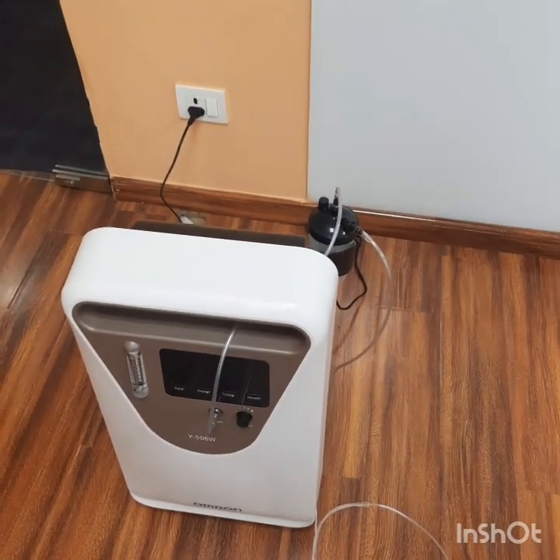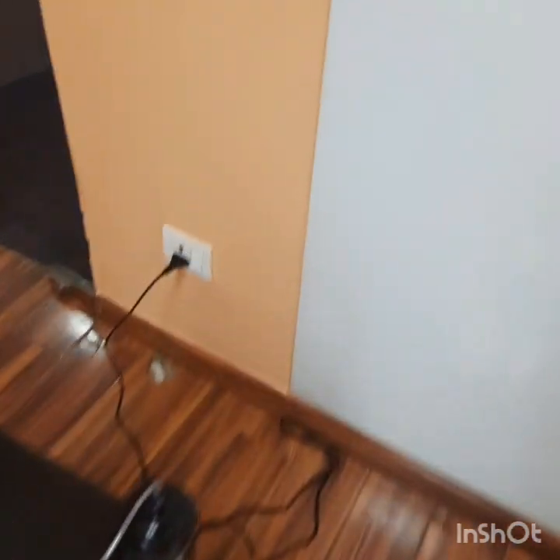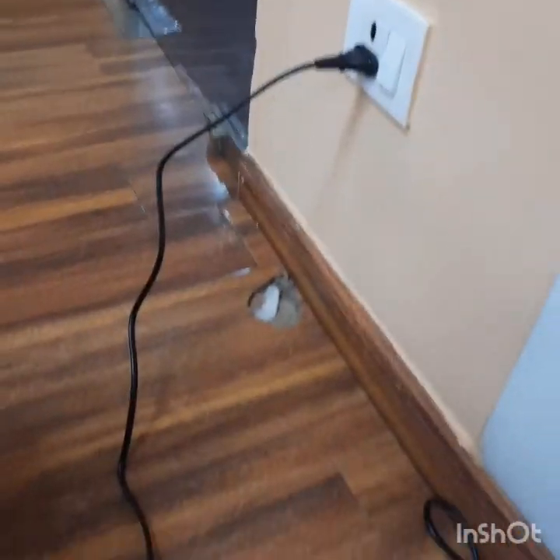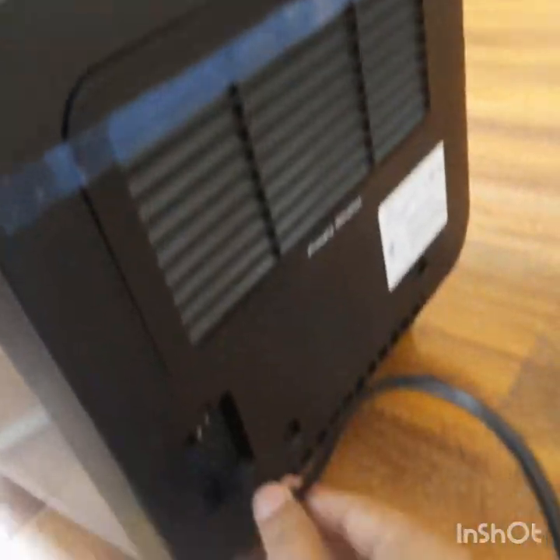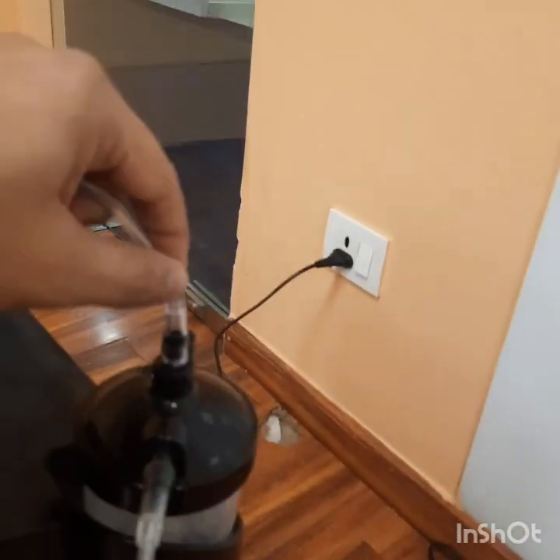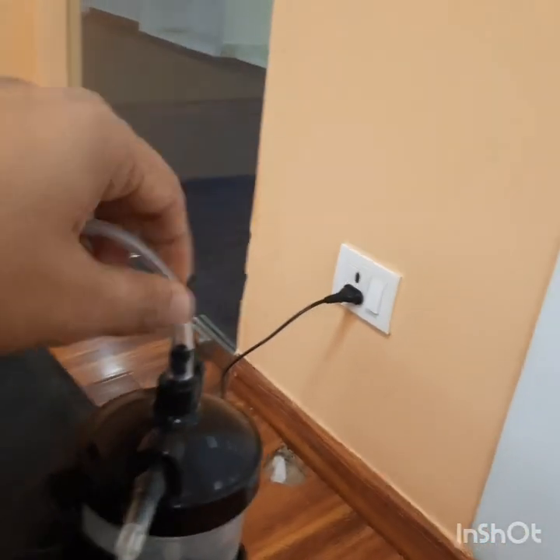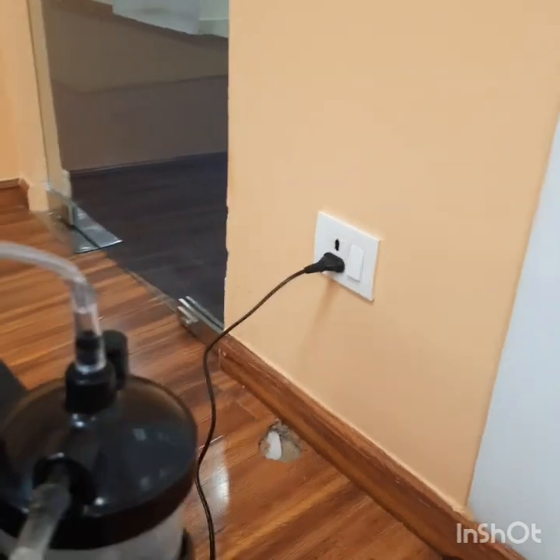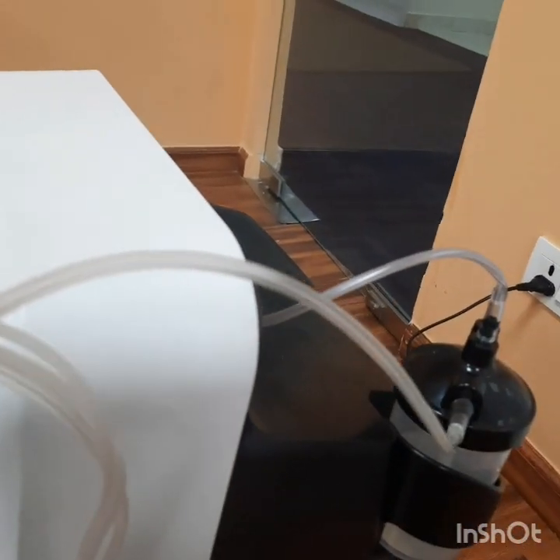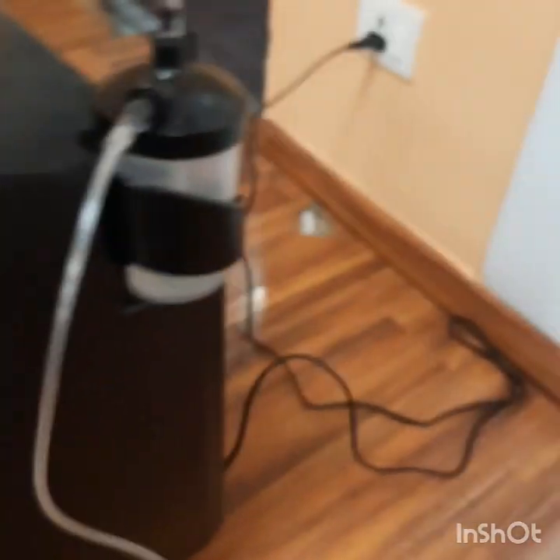Let's see the connections before using Oxygen Therapy. The Power Cord connects from the power socket on the wall to the power socket on the back of the machine. The Oxygen Tube connects from the Oxygen Outlet to the top of the Humidification Bottle. On the front, the Oxygen Concentrator output connects and the tube goes to the patient's nose.